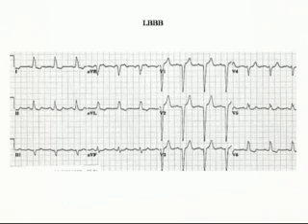An example shown here: mean electrical axis, normal or abnormal? Normal, yeah, so it's positive here. Close to isoelectric in AVF, which should give us an axis of 0 degrees. Then we have a QRS duration that's about 3 boxes long. And we have the top here, see the terminal part's negative in V1. And the top looks like it's notched, like somebody bit off the top of our QRS. So 1, AVL, V5, V6.